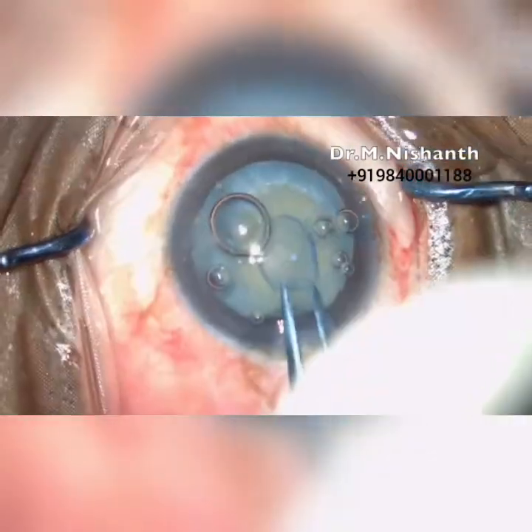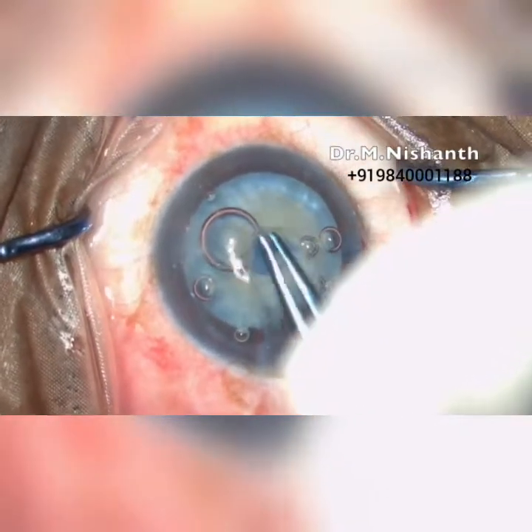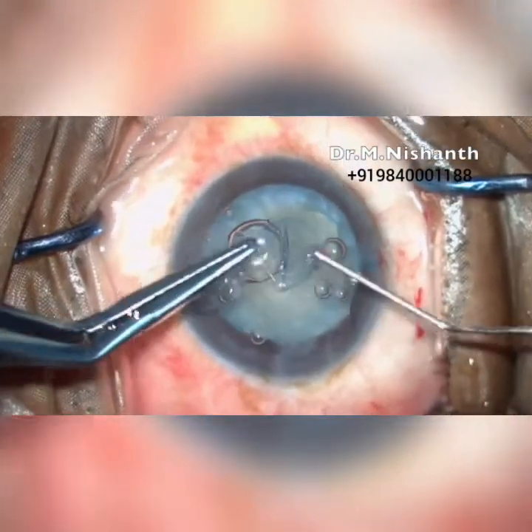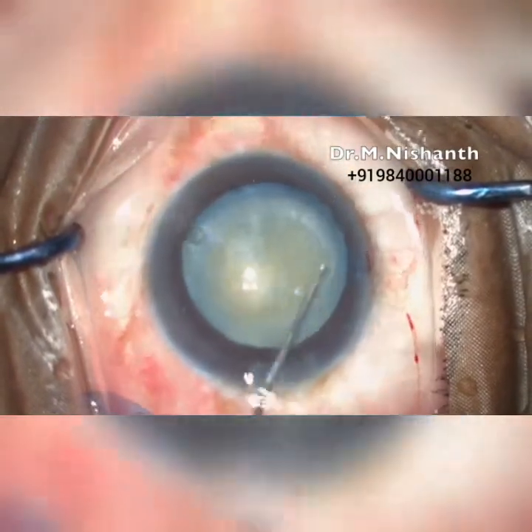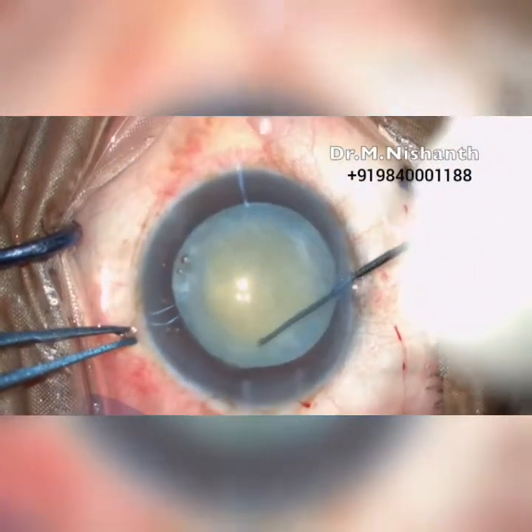See how the intact capsule is made with the zepto. Minimum hydrodissection is done to make the nucleus mobile and to remove the excess liquefied cortex. The nucleus is then rotated.